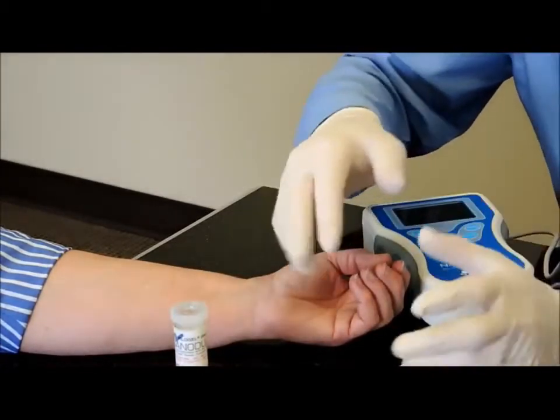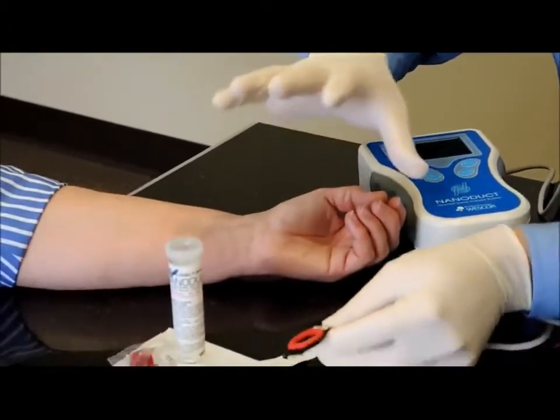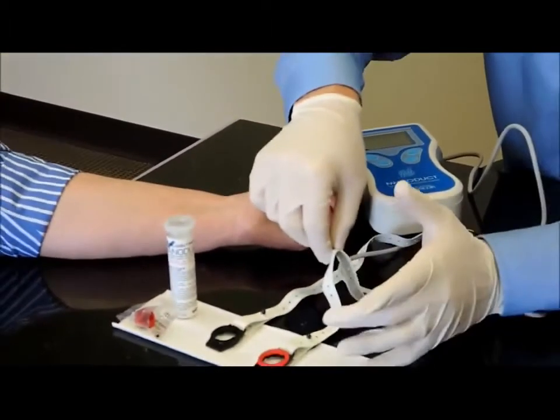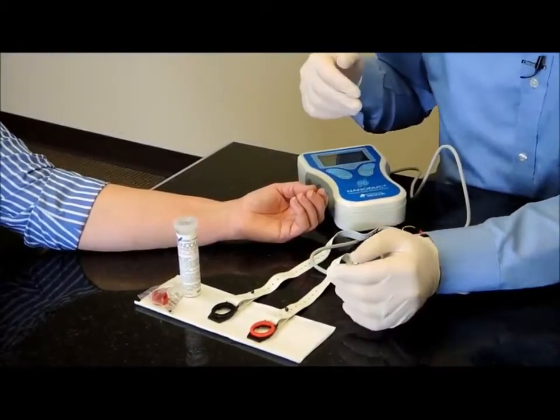Keep in mind I'm wearing gloves just so I don't contaminate the holders with any chloride ions, any salt that may be on my fingers. Also, the straps are latex free. That question comes to us a lot, but they are latex free.